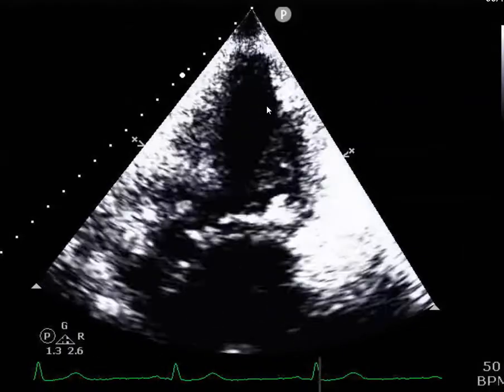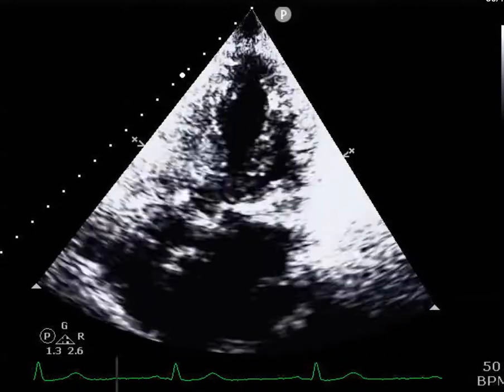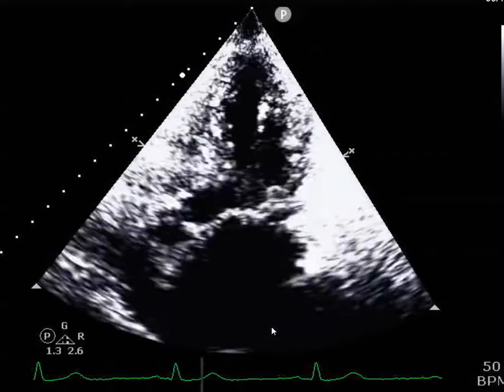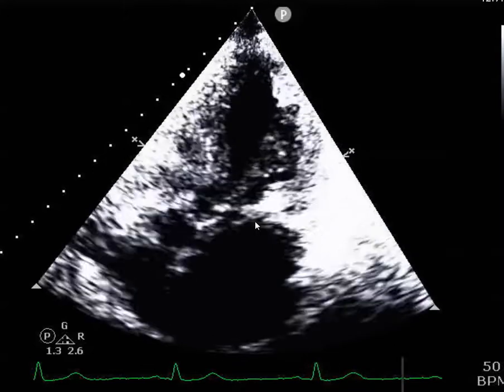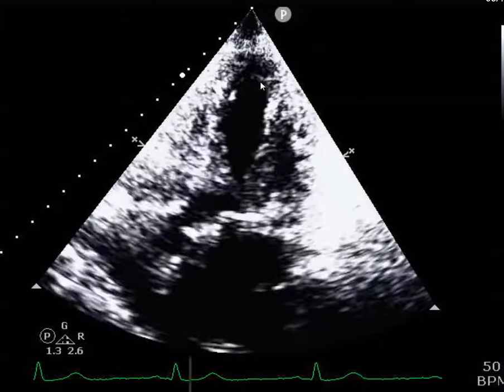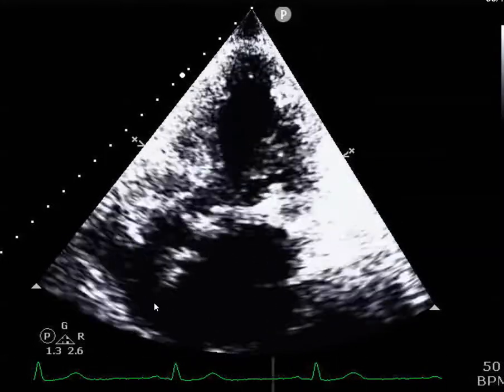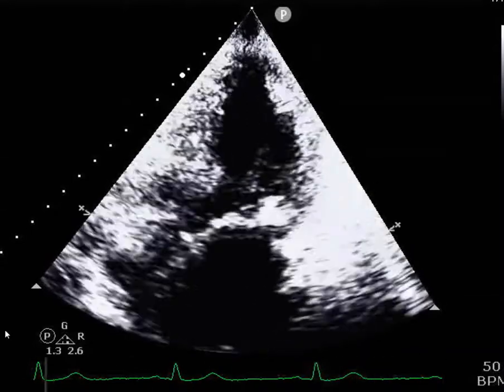The LV appears to be contracting quite well, so the LVEF is pretty high, but just be careful in the setting of mitral regurgitation, your actual forward stroke volume may actually be low because probably half of it, if not more, is actually coming backward through the mitral regurgitation. In cases you see after mitral valve repair, you'll see almost immediately that the LV function goes lower, because the LV is no longer pumping into the LA, it's strictly pumping into the LVOT. So it's very common to see after mitral clip or after mitral valve surgery for mitral regurgitation that the LVEF actually goes down.